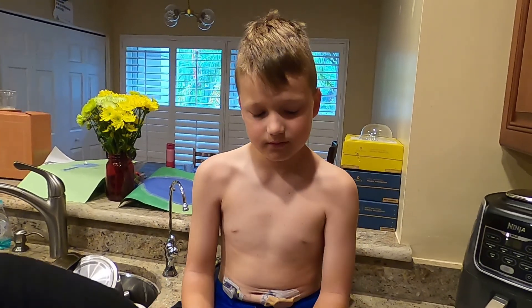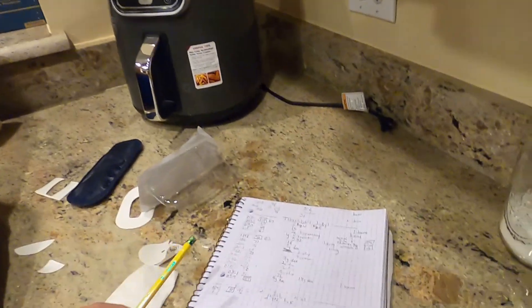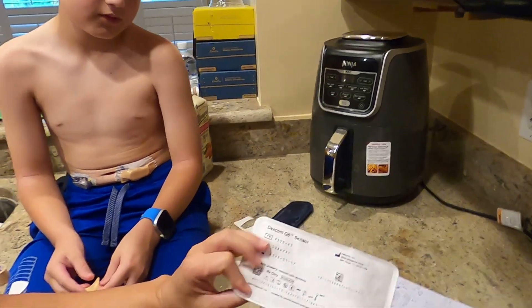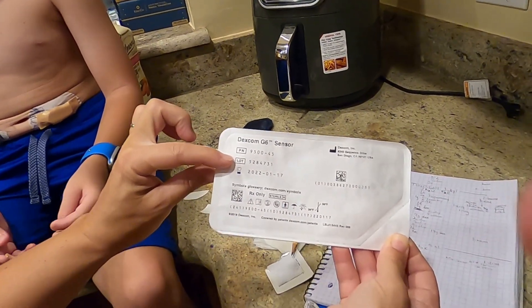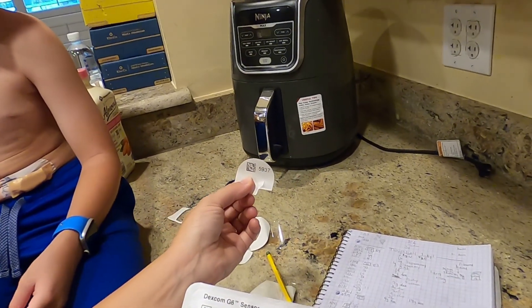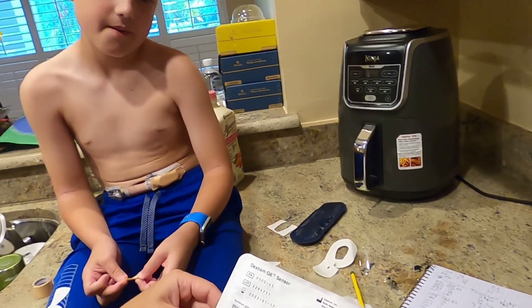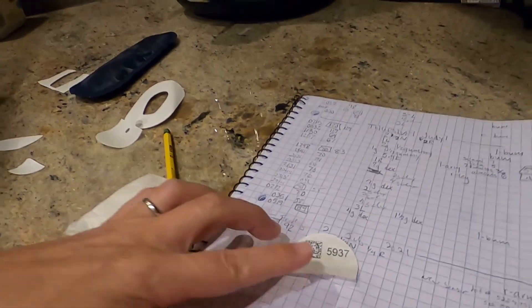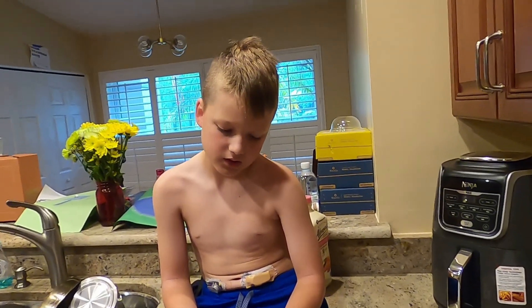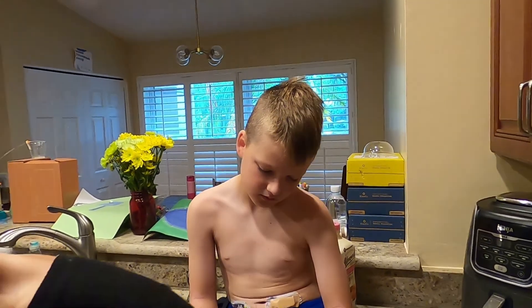Last thing — so for Porter, for you and your parents: write down the lot number here and keep the pin off of the sticker. Keep that and write that number down because that's what you'll need to set up and start the new sensor — to enter this code and then the lot number in case you have to call Dexcom. It helps to have that handy, although they can kind of tell already which one it is. We just write it right in Abel's tracking book.